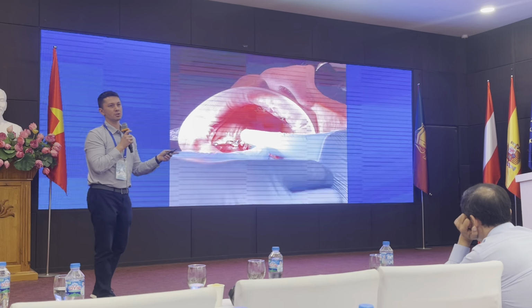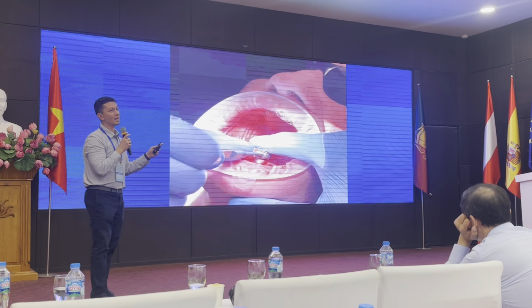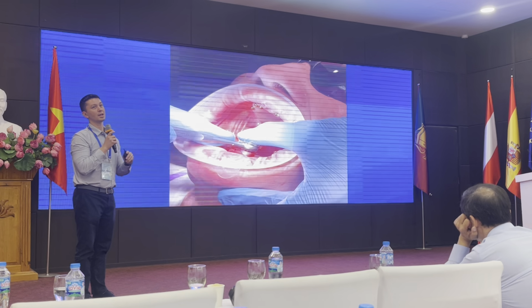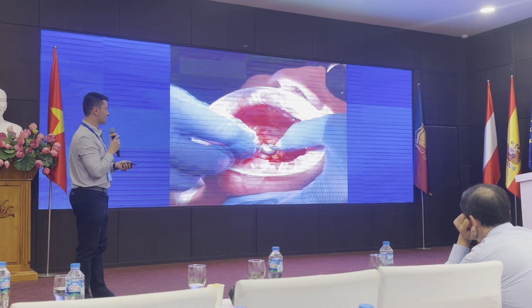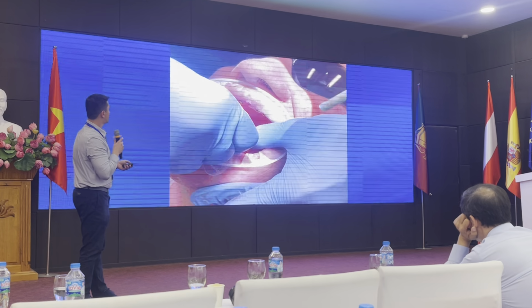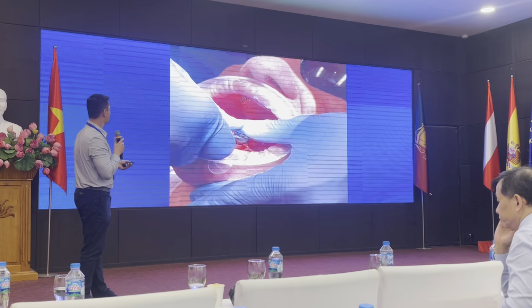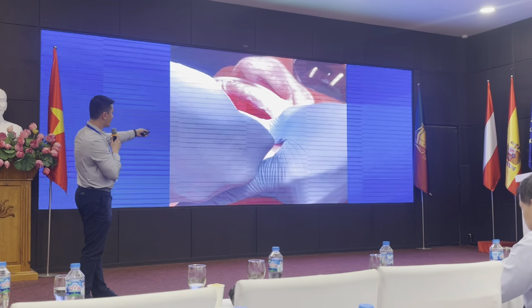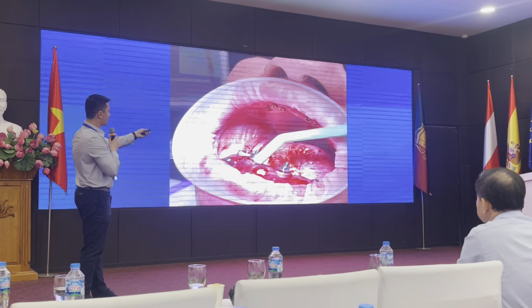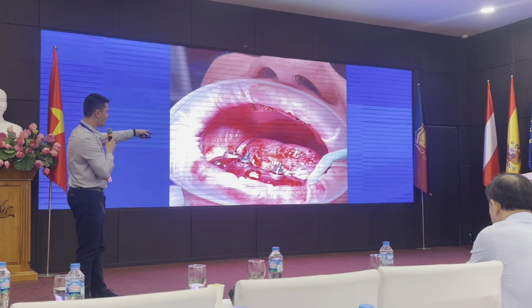With this type of procedure, especially guided, guided and TSX implants, you're going to get a ton of primary stability. There's a lot of success with this. And see, it's on so tight, you have to carefully move the torque wrench around to get it off of the fixture mount.